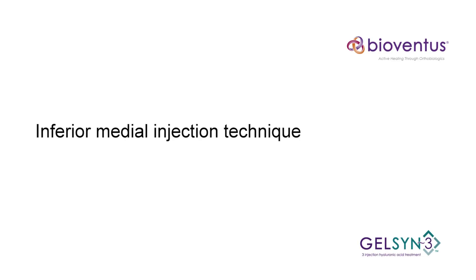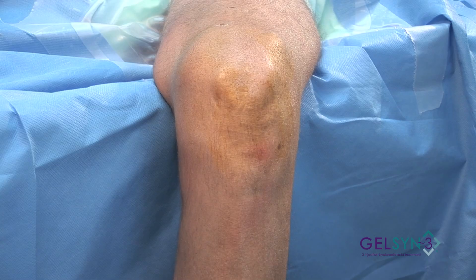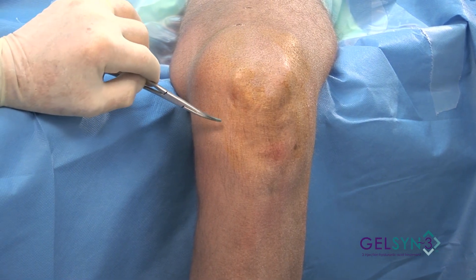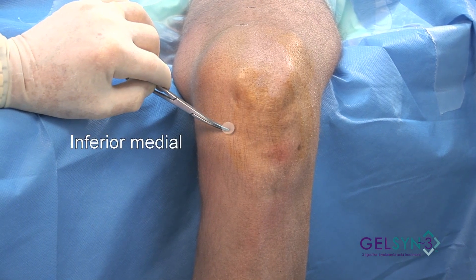Inferior Medial Flexed. We're going to insert our needle through the medial inferior portal with the knee flexed.